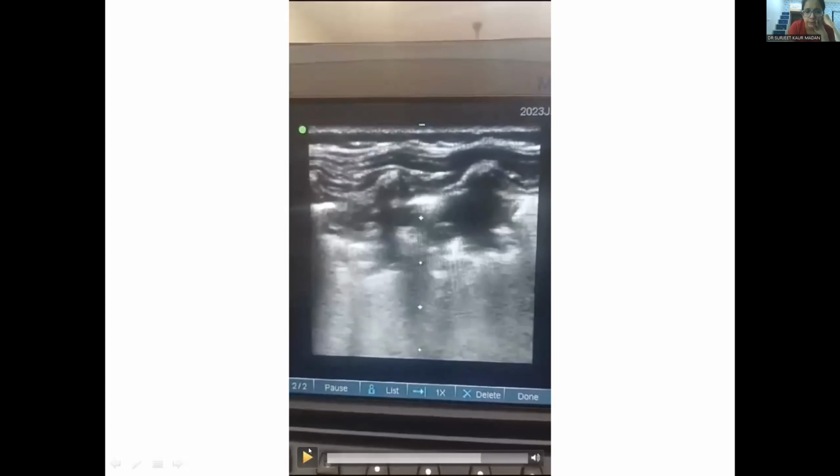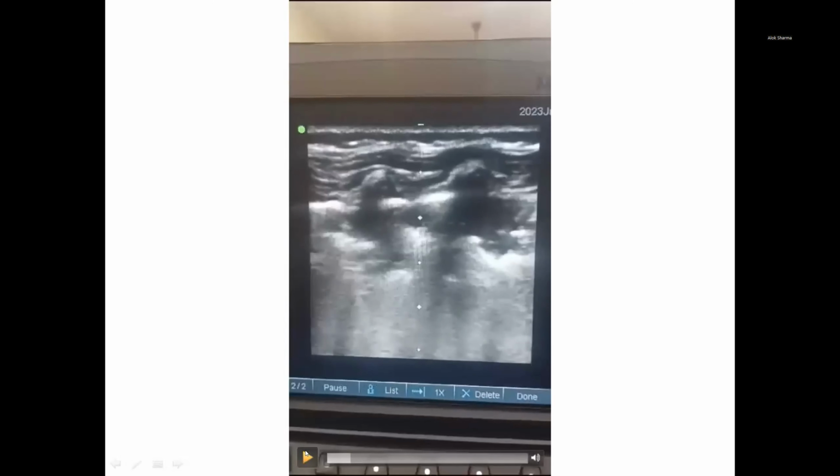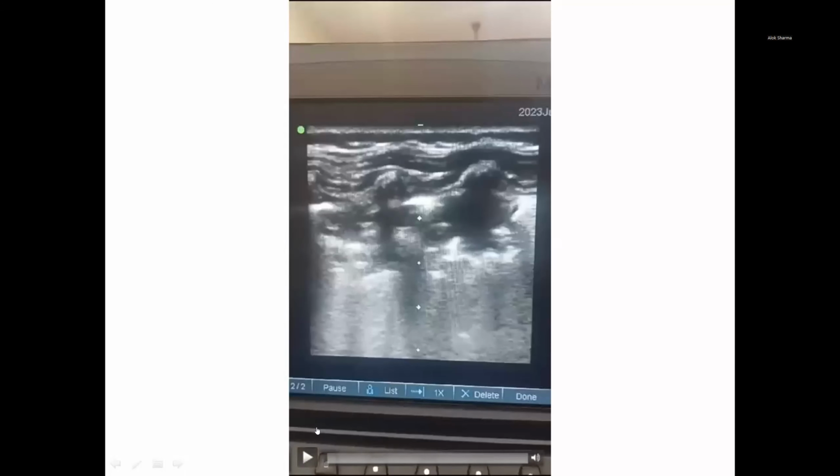Right, right. Now, if you look with the eye of faith, this goes in and out. So I just wonder whether that's a dynamic air bronchogram that you see. I think the baby is having distress and is moving a bit, but in the rest of the areas, they look very static. I'll just play it again. Yeah, sure.